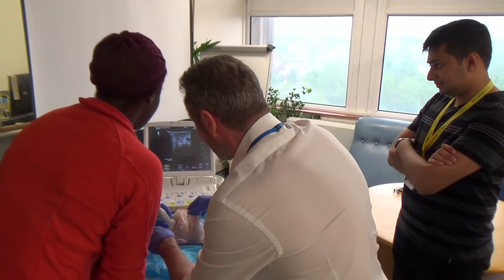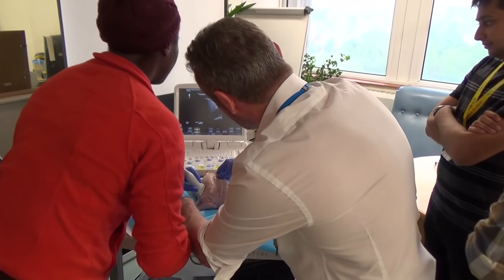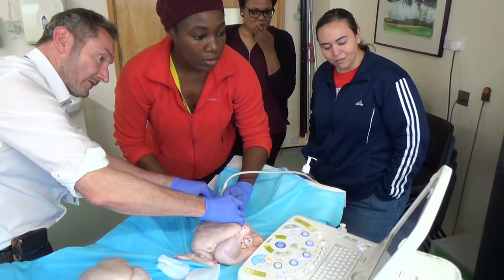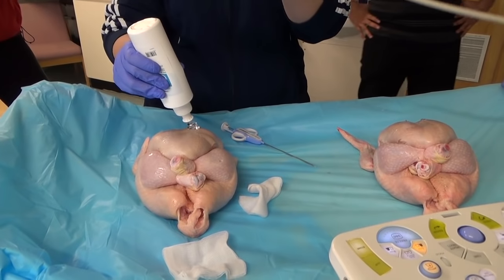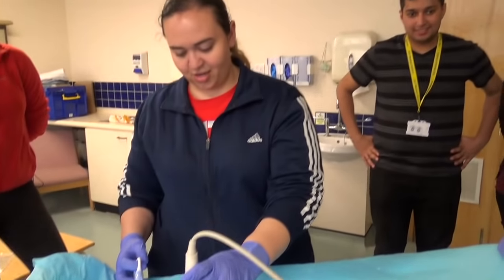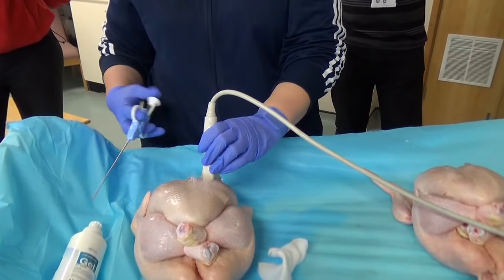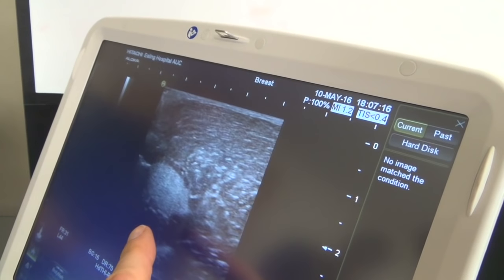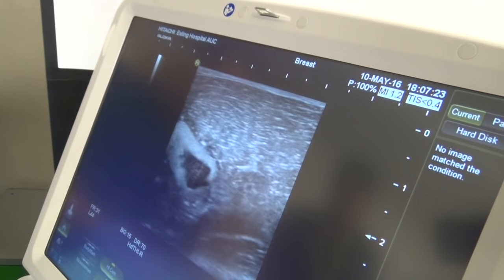First, I want you to see — look at this. There's a fan of ultrasound, a thin plane, and you've got to be in that plane. There is an olive. So it's to the left — you can come back a bit. There is the olive with the garlic in the middle, in amongst the flesh of the chicken breast.